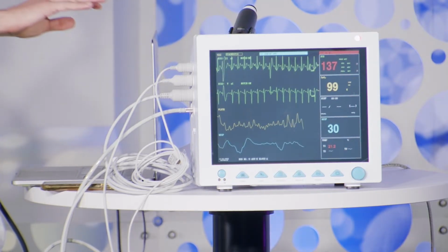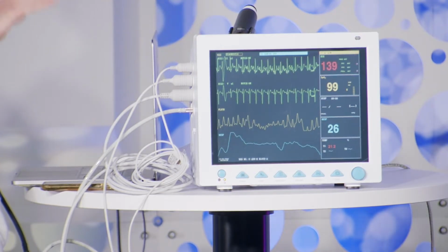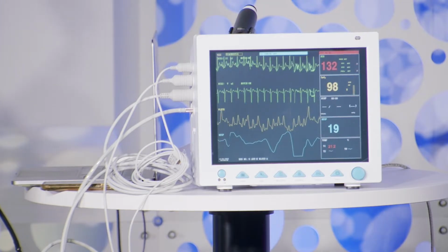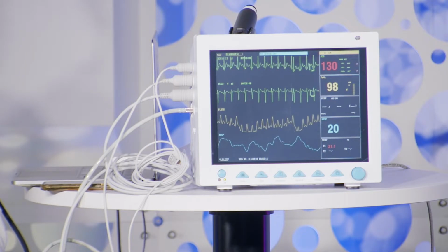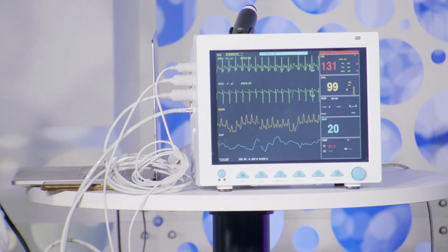So okay, we have the patient monitor. We have our customized backdoor. We have the application that controls it, and we also have what you see in the matrix-style green text on the screen. This is the CNC server. The app that we built is talking to the CNC, and the patient monitor's backdoor is collecting payloads from the CNC. So we can actually control whatever we want on the patient monitor through the application that communicates with the CNC.